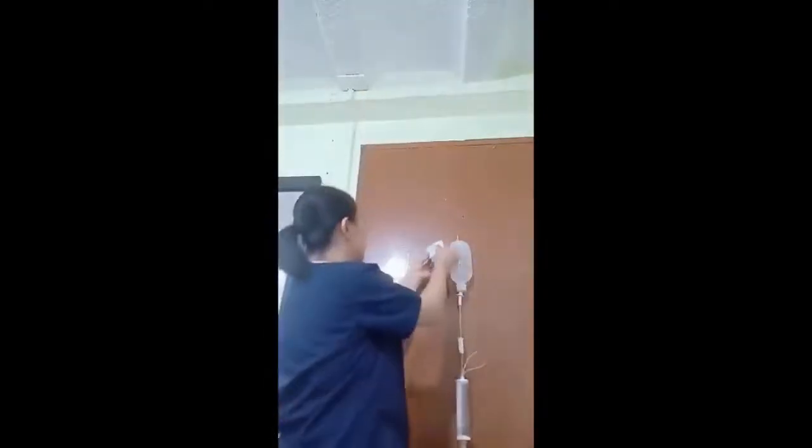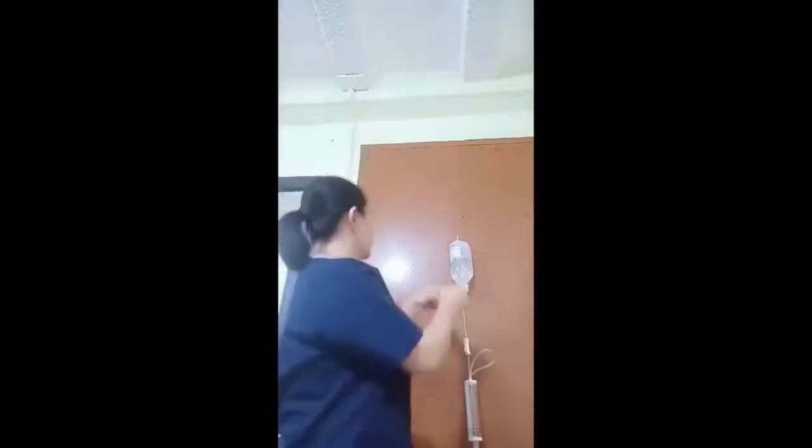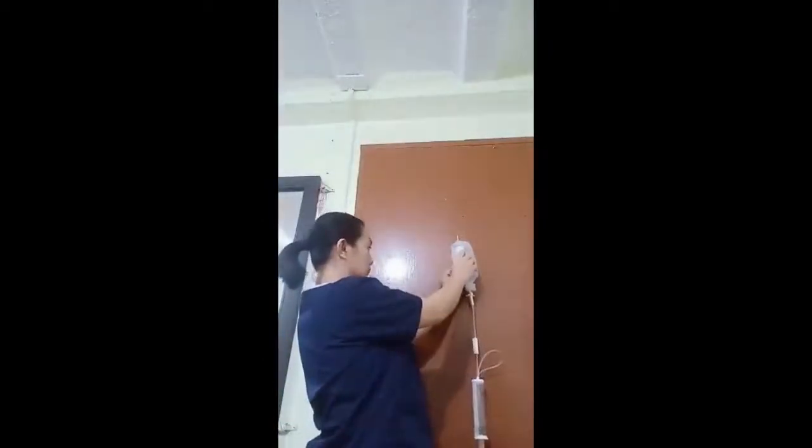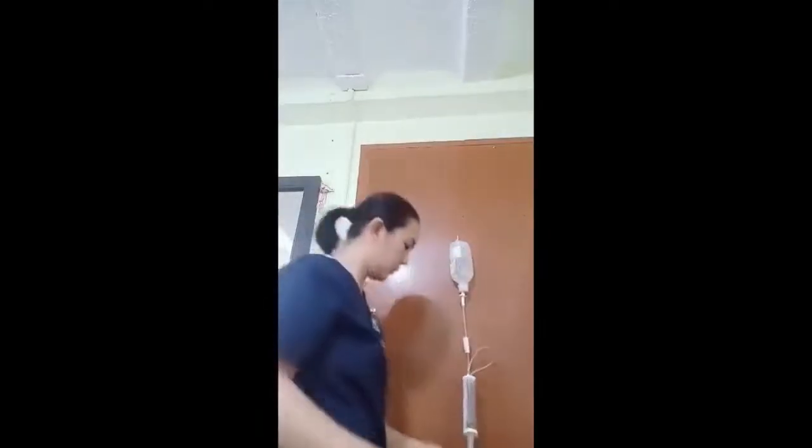This alerts the nurses that medication is being infused. It also prevents other medication from being added in the Soluset. And then observe the patient for any adverse reaction, so that IV medication will act rapidly.